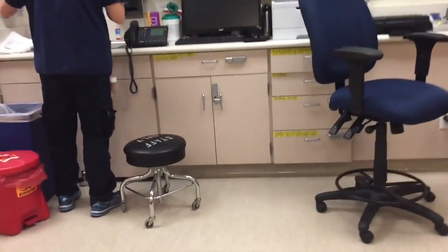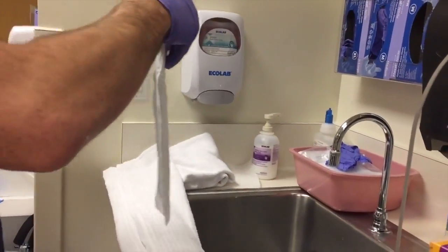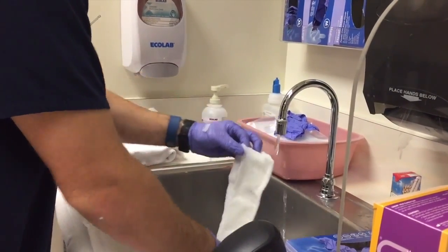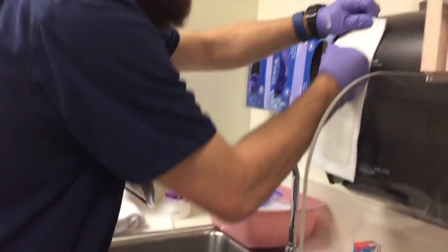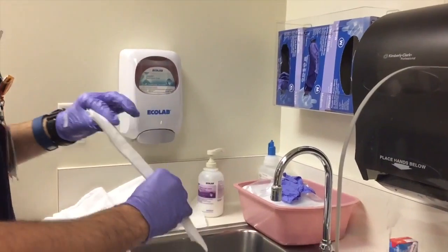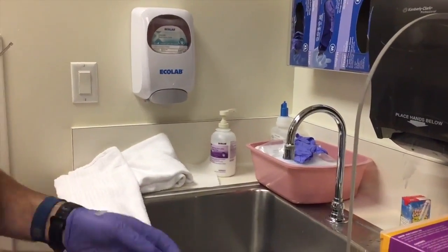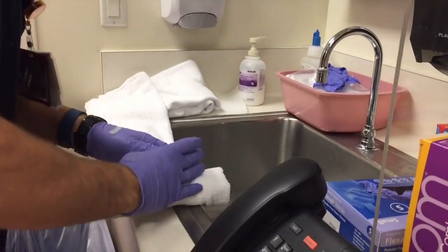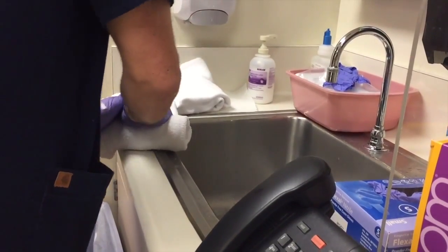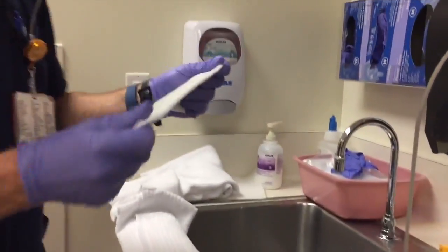What Kevin's doing right now is the same thing we did earlier. We're going to get it wet, open it up, put it on the inside. These will start to harden just by the air, and water is going to make them start to cure a little bit faster. I like to put the water on the inside. Some people will roll them up and dip them in water, and some will just put water on the outside. This way, by going inside, you're not getting the padding on the outside wet and wrapping that moisture against the patient's skin. This way it's a little bit more dry.